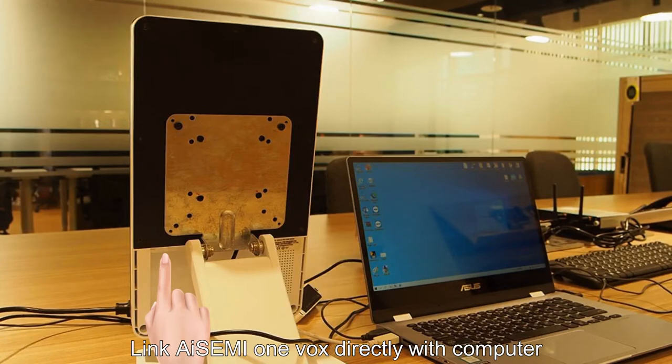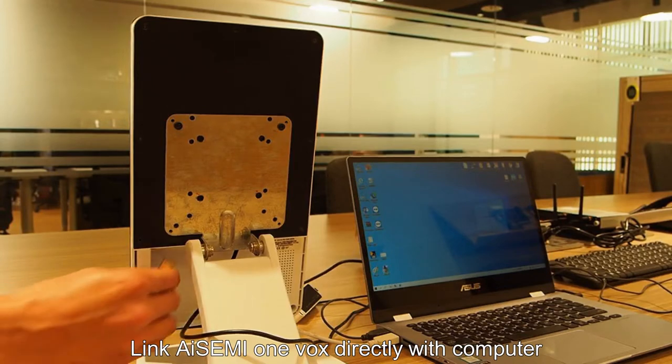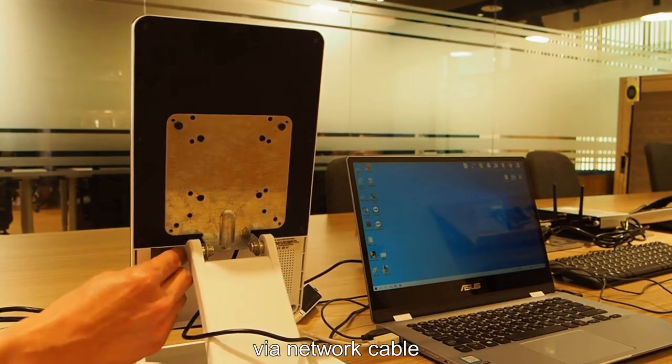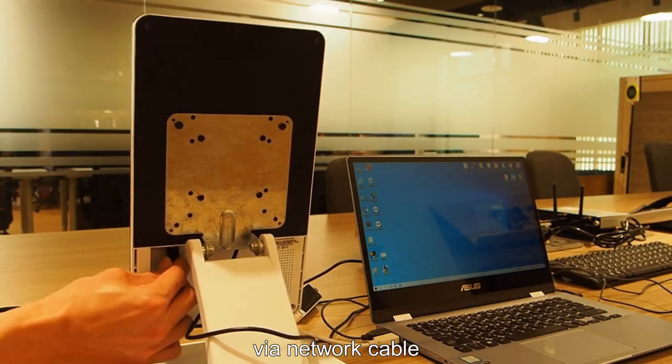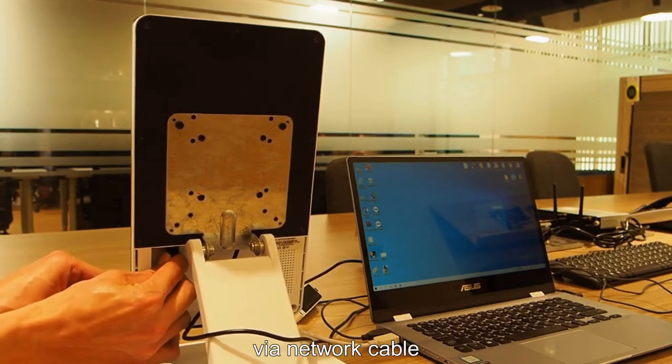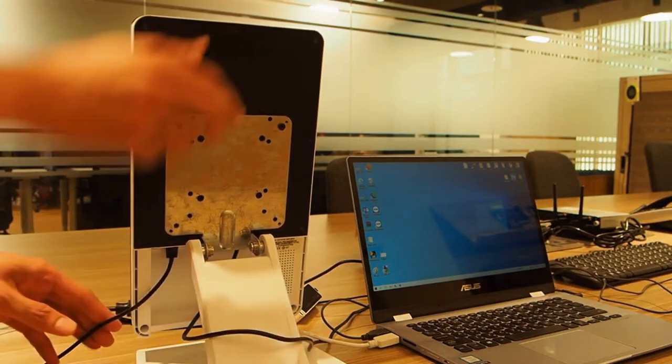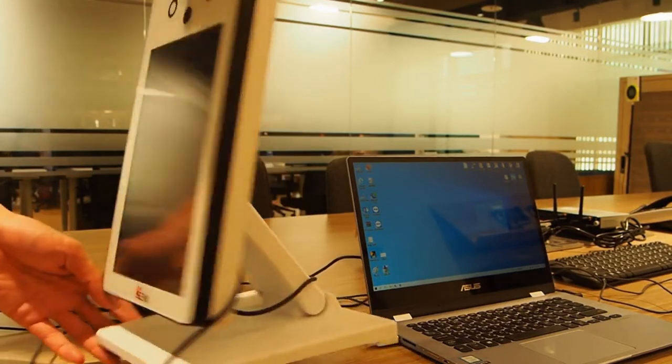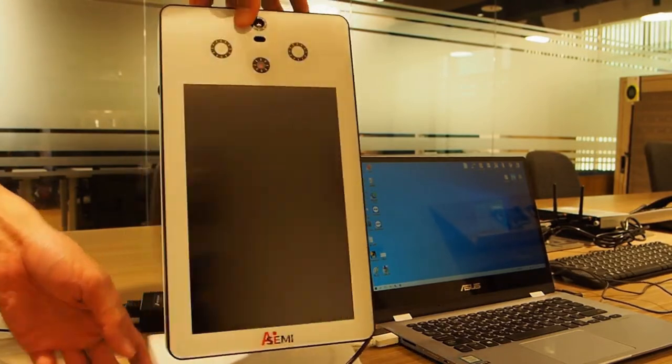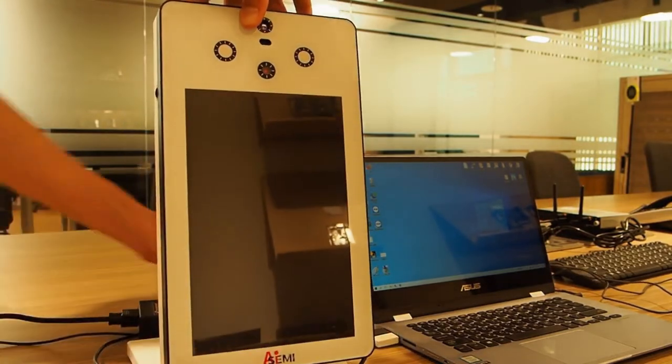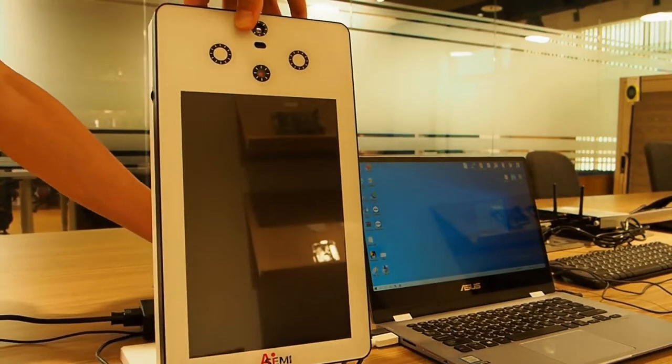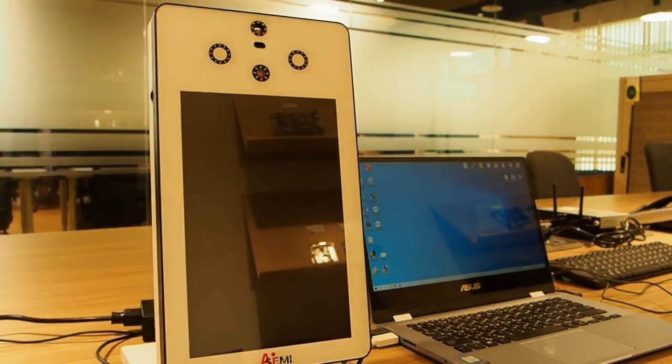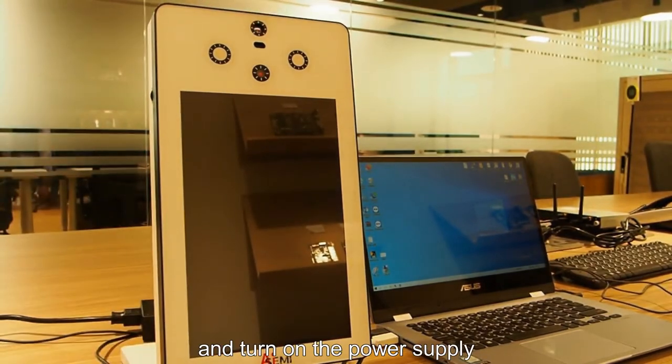Link AiSEMI one vox directly with computer via network cable and turn on the power supply.